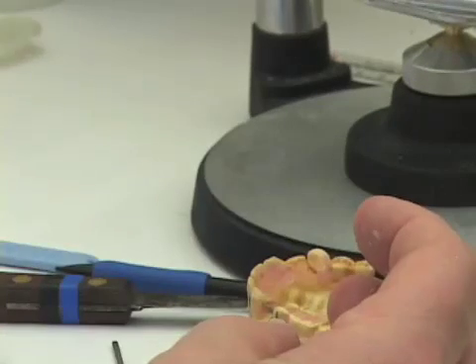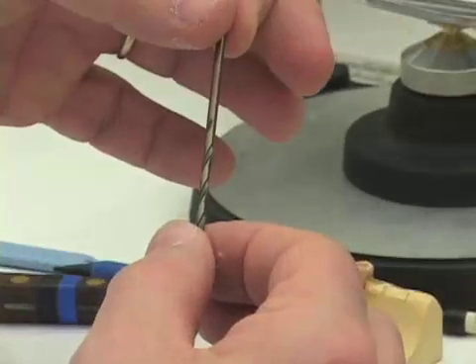The next drill we would move to is the next size of our surgical drill, which is the 2.8 drill.